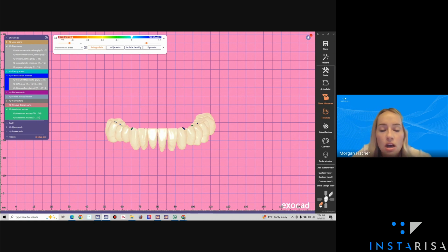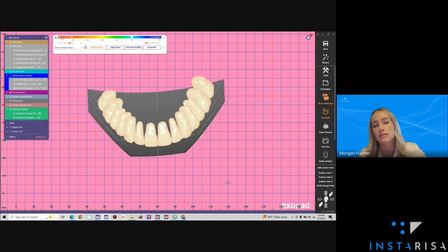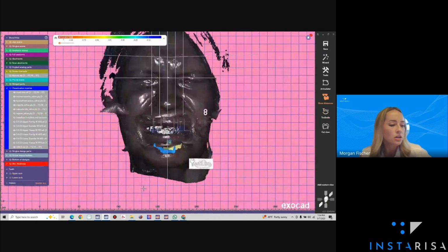And when I'm turning this off, my lower buccal cusps aren't too high, in appreciation of the curve of Wilson there. And like I said, upper lingualized contact. So we're looking for lingualized occlusion on the upper with that central fossa occlusion on the lower.